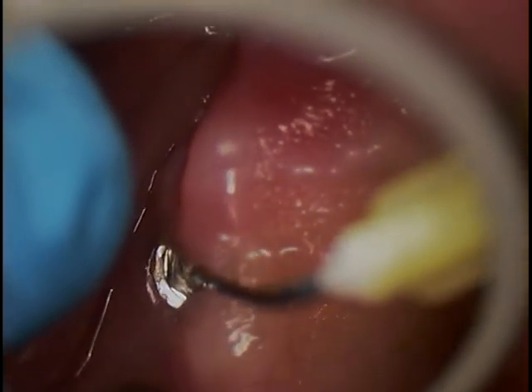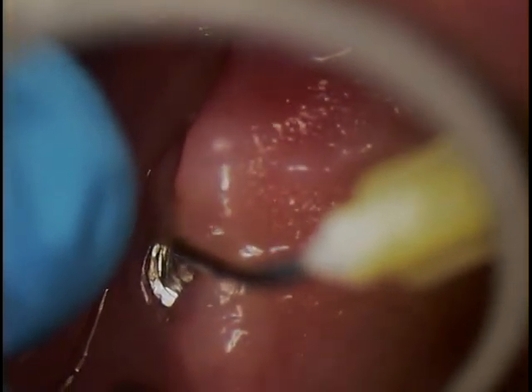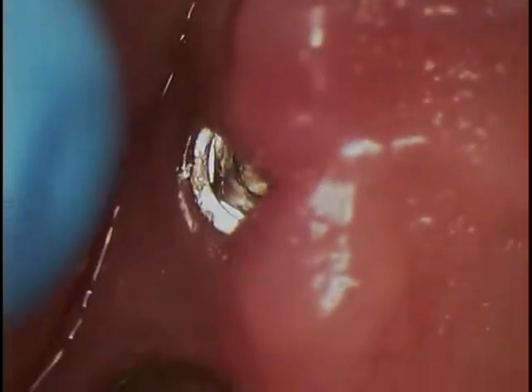Our mission is to see if we can get this screw fragment out. It's unfortunate to see the abrasion here.